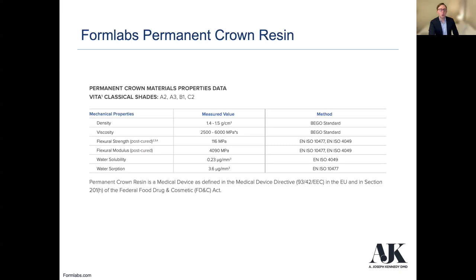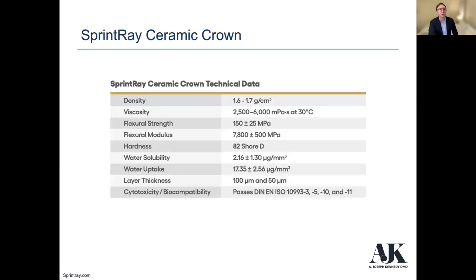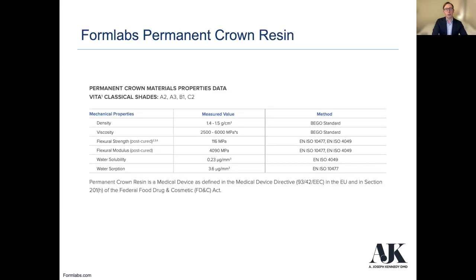So definitely not as strong as a flexural strength, even post-cured from these crowns, but reasonable to be used in a patient's mouth if needed. Here's another ceramic crown. This is the Sprint Ray ceramic crown. You can see that their flexural strength at 150, their flexural modulus a little bit higher here at 7,800.